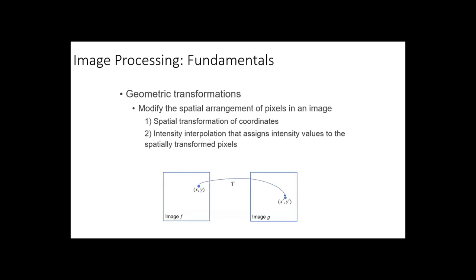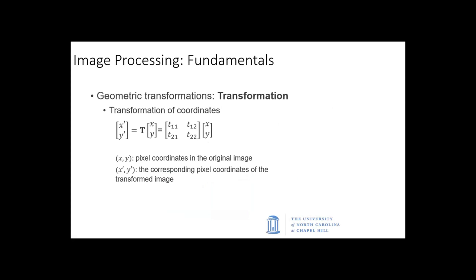So you can do linear interpolation, you can do nearest neighbor. Basically, because this one is close to this grid point, we just give the value on this grid point to this point, right? And we can do linear interpolation, or other fancy interpolation methods. So the point here is after the geometry transform, you're going to move this point to a new location, which is not exactly on the grid. So we need to use interpolation to get the values, and then we can do the geometry transform.